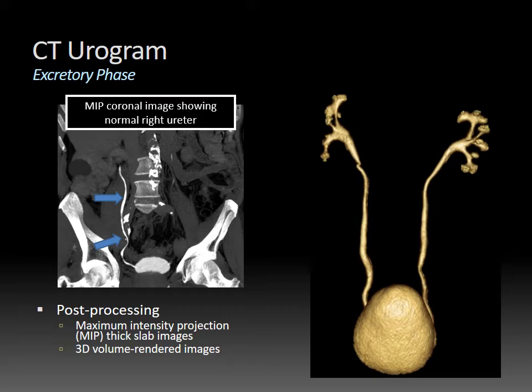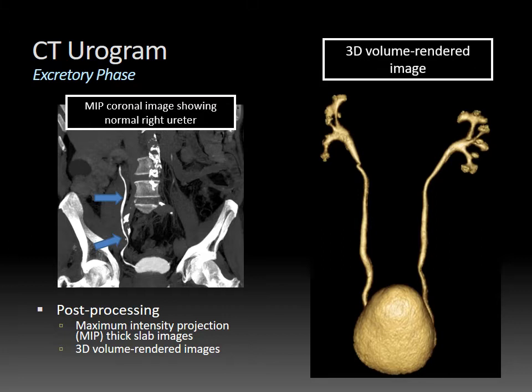Another technique is to generate 3D volume-rendered images, as in this case. This is a surface rendering of the collecting system, ureters, and bladder showing a normal patient. This is a great way to further characterize complex genitourinary anomalies like congenital anomalies.